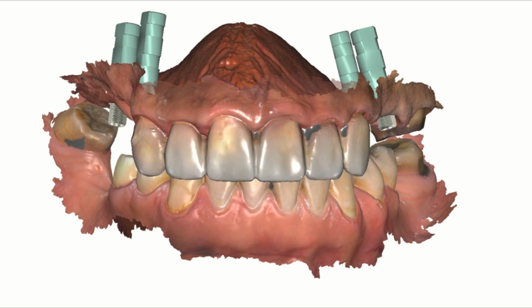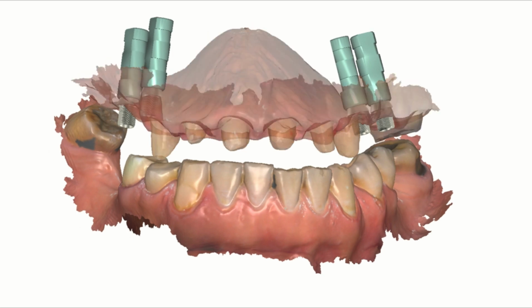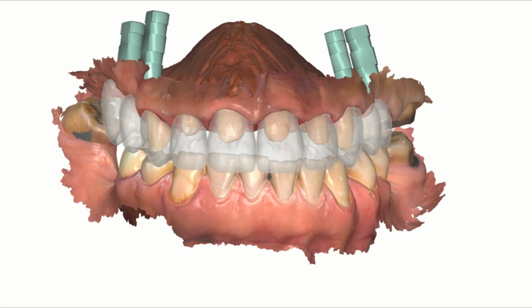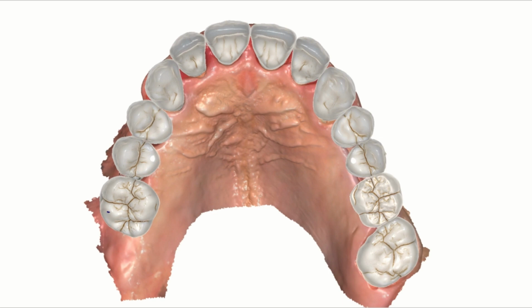Here is the case before preparation of the anterior teeth. Here are the teeth after preparation, having lost the original bite in reality, but this bite is still preserved in the virtual software. So in reality we lose the bite, but in virtual, after preparing the teeth and losing the stoppers, we still have the relation between the upper and the lower arch. Here is the design of the screw retained prosthesis and the crown and bridge anterior restorations. Look at the full arch rehabilitation case.